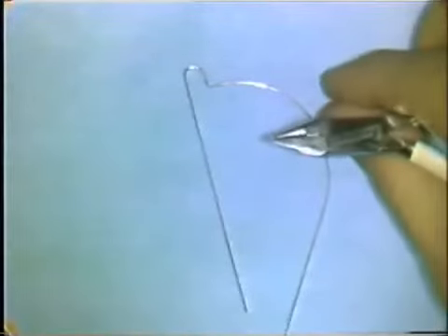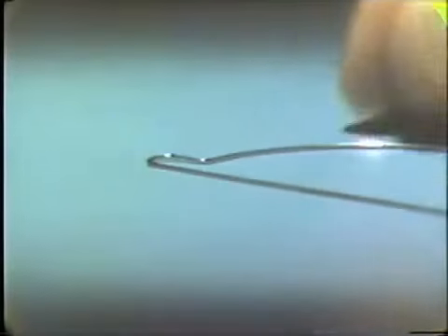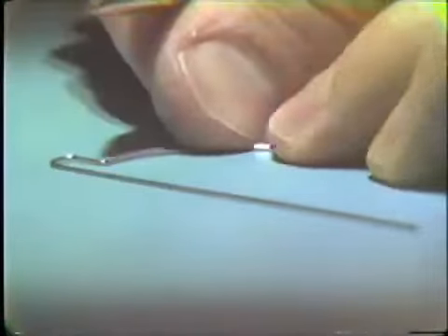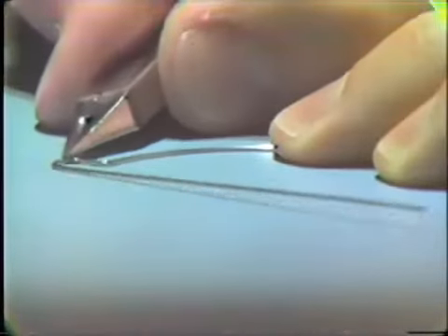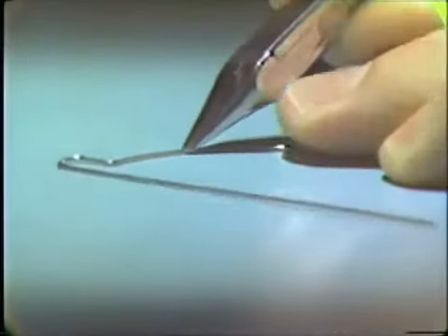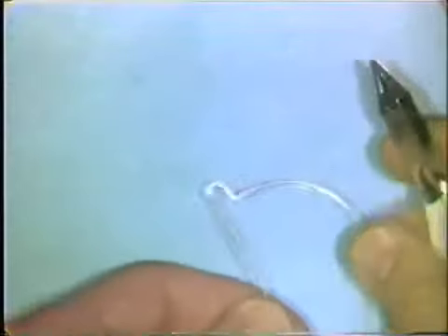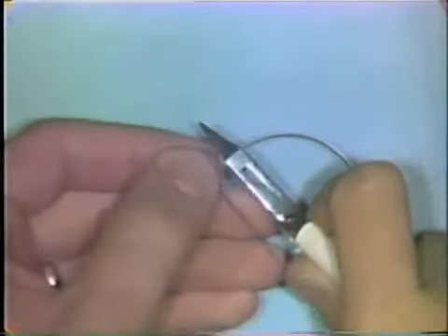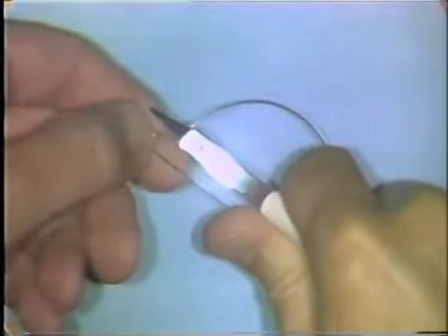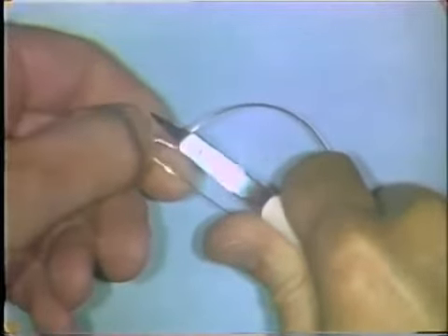Now, as you view it from the side, the curvature is flat on the table, and this loop portion is almost flat. Very slight deviation from the table surface. To correct that, you want to bend the loop down towards the table. So you place the plier beaks on the curved portion. Use the flat base portion of the plier for all of this flatness adjustment, and hold the wire and push downward on that loop.